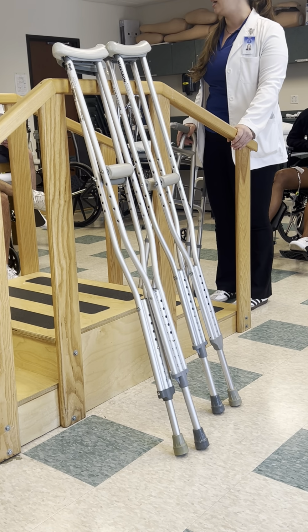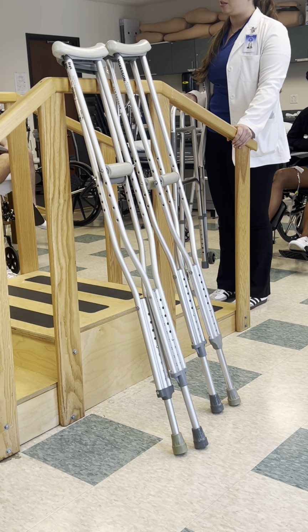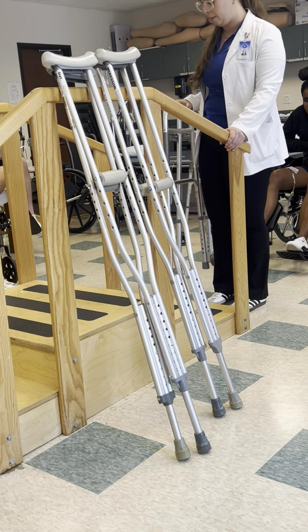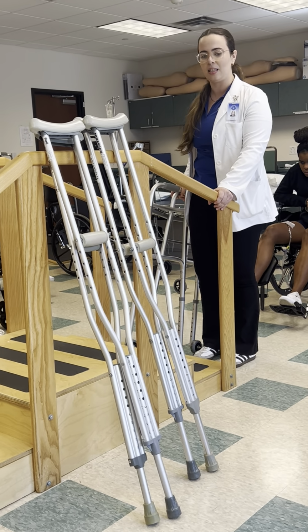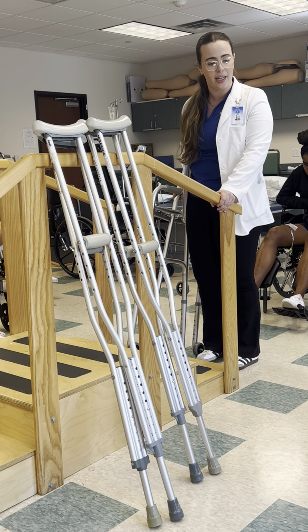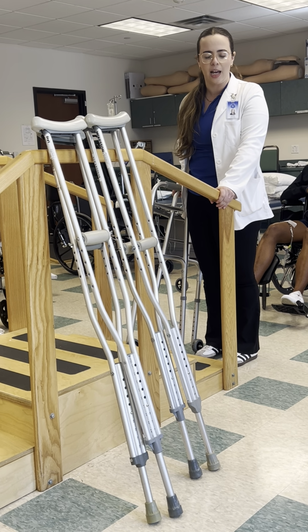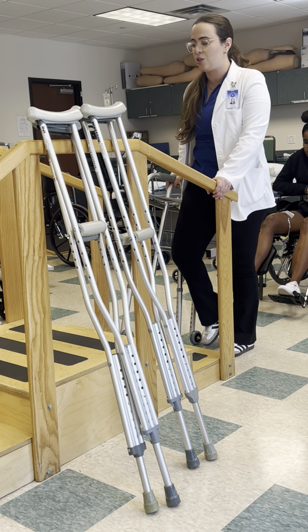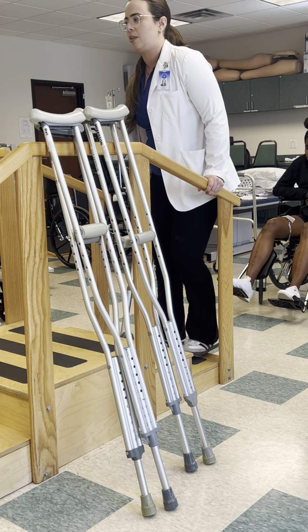I'm going to go again nice and slow, alright? It's different for crutches. I'm using the rolling walker first. When my patient starts, first is the assistive device. In Claudia's case, her left side is the involved side. Therefore, the right side, which is the uninvolved side, goes up first and then the involved side.